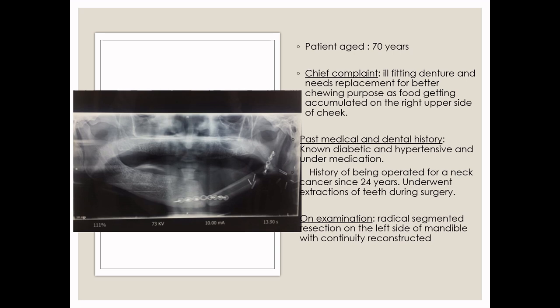The average diameter of this fibula free flap is just 1.5 centimeters, and when used to reconstruct the edentulous mandible, the fibula height closely approximates that of an atrophic mandible. When compared, there is roughly a two-fold height difference between the fibula and the native mandible. You can clearly appreciate it here. This discrepancy is most critical when reconstructing defects in the anterior mandible.